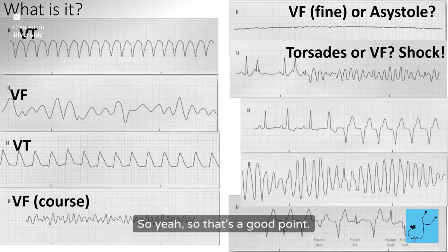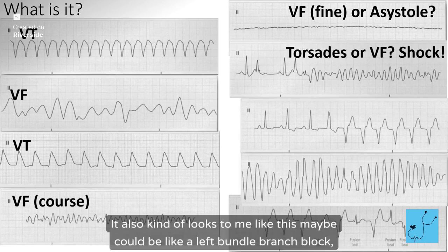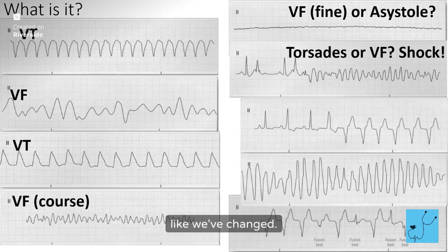Okay, yeah, that's a good point. It also kind of looks to me like this maybe could be a left bundle branch block, like we've changed rhythms.